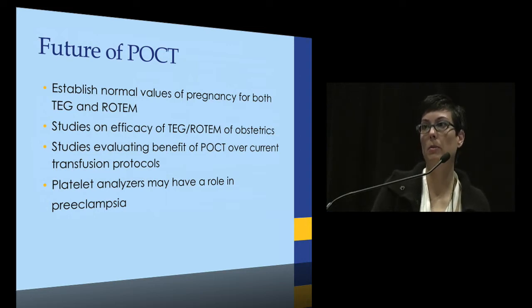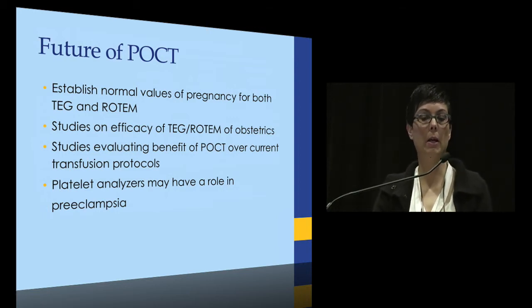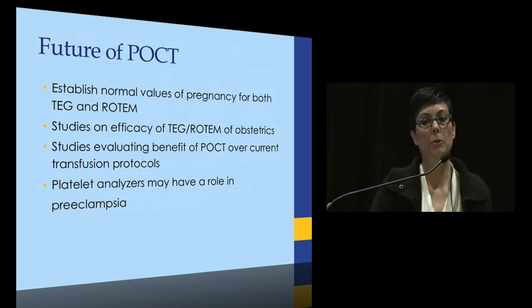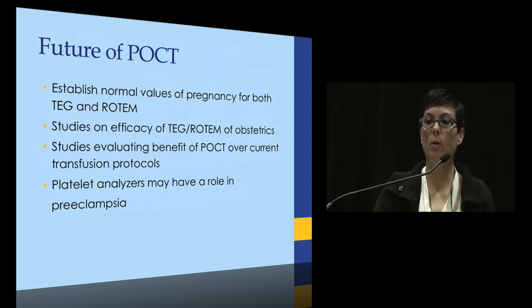It's an expense to obtain, and it's an expense to maintain, for either one of them. And with the platelet analyzers, there are still limitations in the time it takes to get that information. The patient may be delivered by the time you get your results from your platelet analyzer if you have to send it out. So there may be a role for it, but we still need to look into it and decide what that role is in specific settings like preeclampsia.